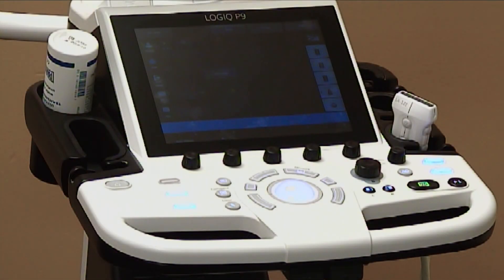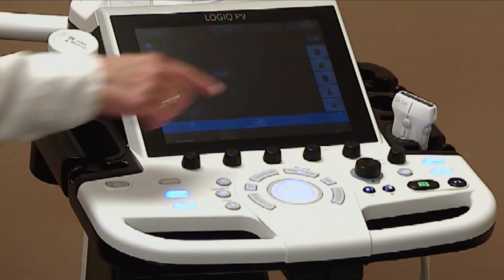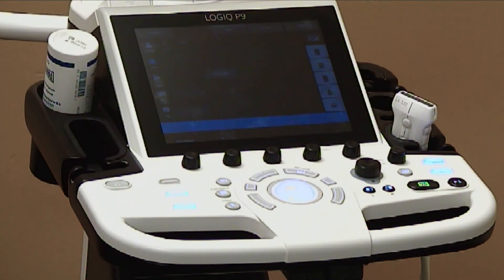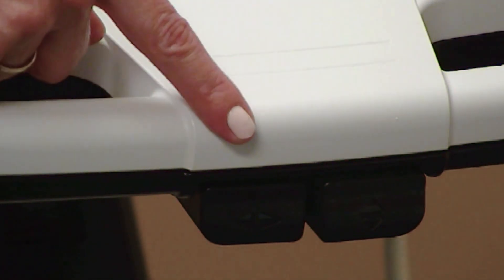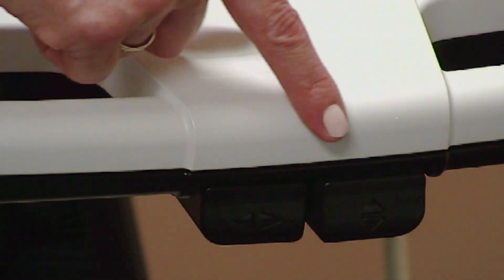On the side of the control panel, there's an optional gel warmer as well as transducer holders. Beneath the operator panel, there's room for an optional keyboard. There are also two buttons: one to swivel the control panel and the other to adjust its height.